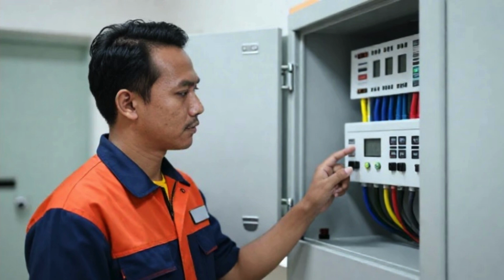To begin with, let us understand what electrical hazards are in the context of medical equipment. Electrical hazards include electric shock, leakage current, short circuits, overheating, and fire risks. In hospitals, these hazards can occur due to damaged cables, poor grounding, insulation failure, or improper use of equipment. Moist environments such as operating rooms or intensive care units can further increase the risk of electrical accidents.